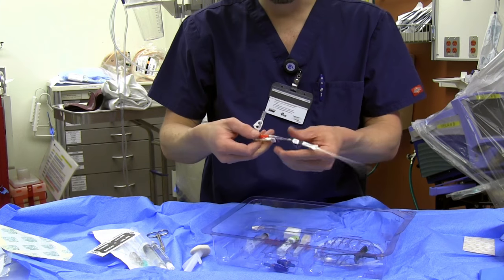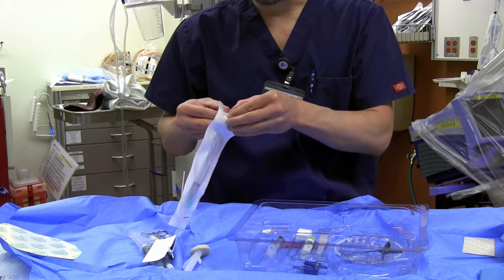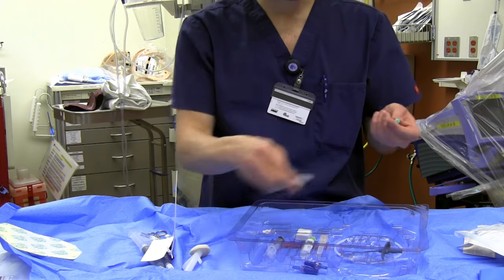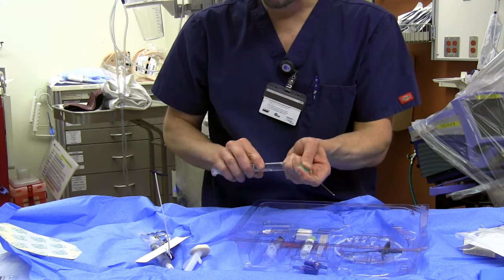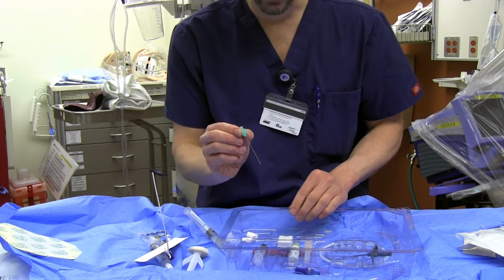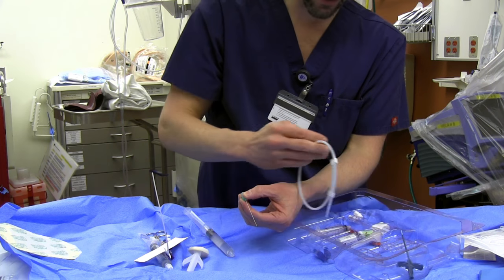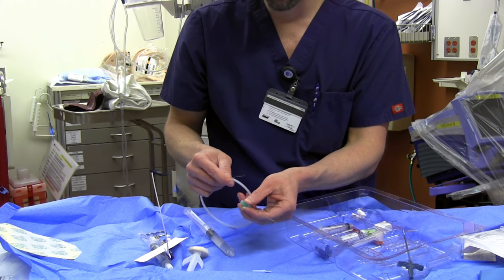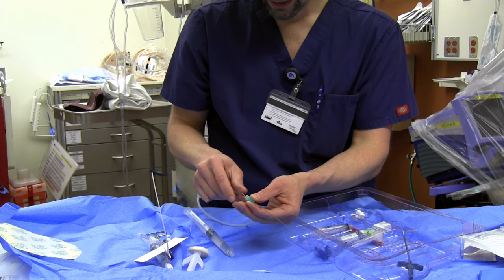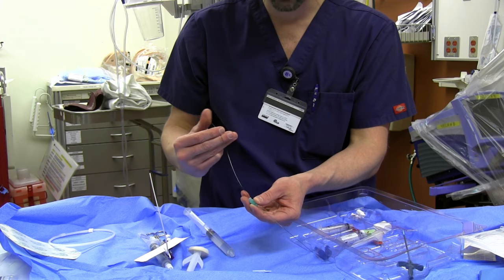You're going to flush the catheter in both ports. The line's now ready. You're going to get your needle — there are two: one's the safety, we don't use that one; there's the non-safety, we like that one. You're going to go in and you can either attach a syringe to your needle and go that way, or you can just go straight up needle if you're going with ultrasound. One way or another, you get your flash. Once you get your flash, you're going to grab your wire — it's super flimsy. Advance your wire at least halfway in. Don't use the back end — it'll destroy the patient's vessel.